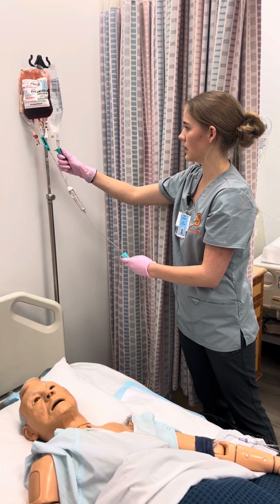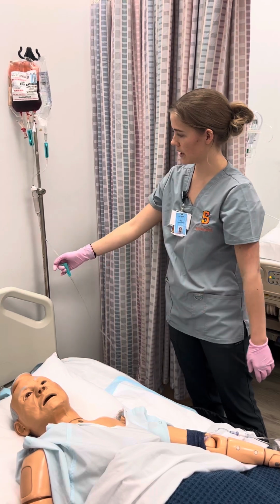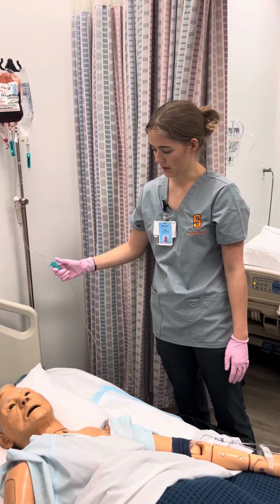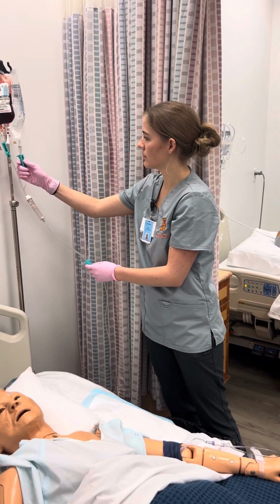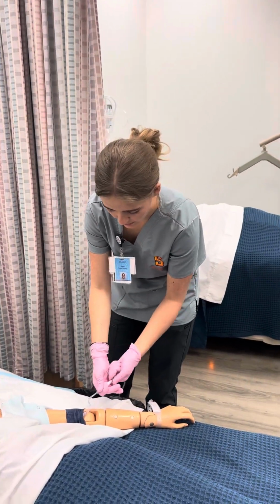And I'm gonna let the saline go through. Great, it's dripping really well. I'll let that whole thing flush out. And I'm gonna go ahead and clamp everything. And yeah.